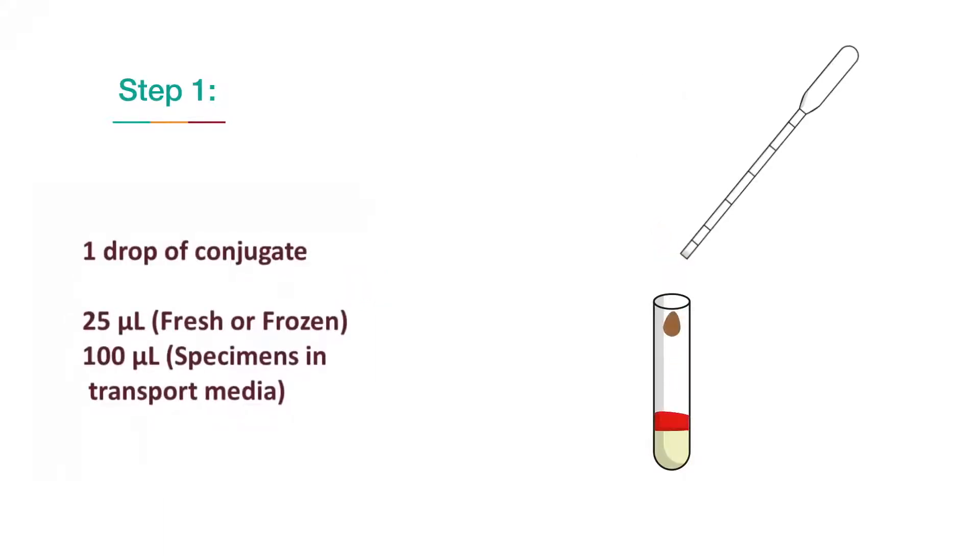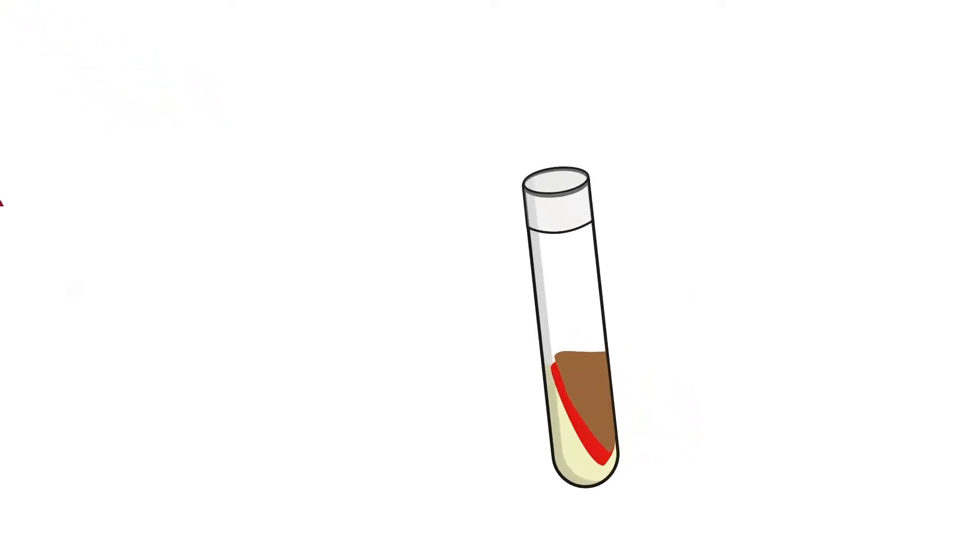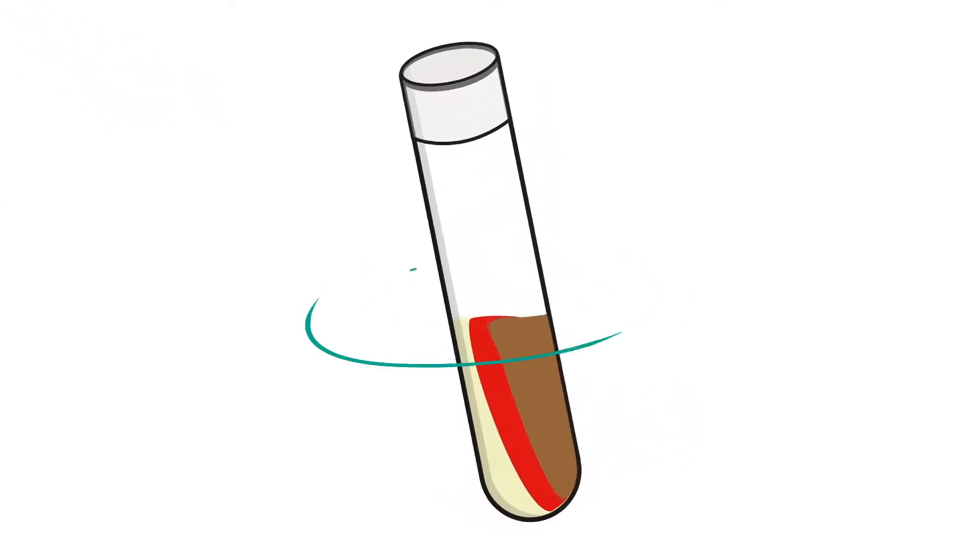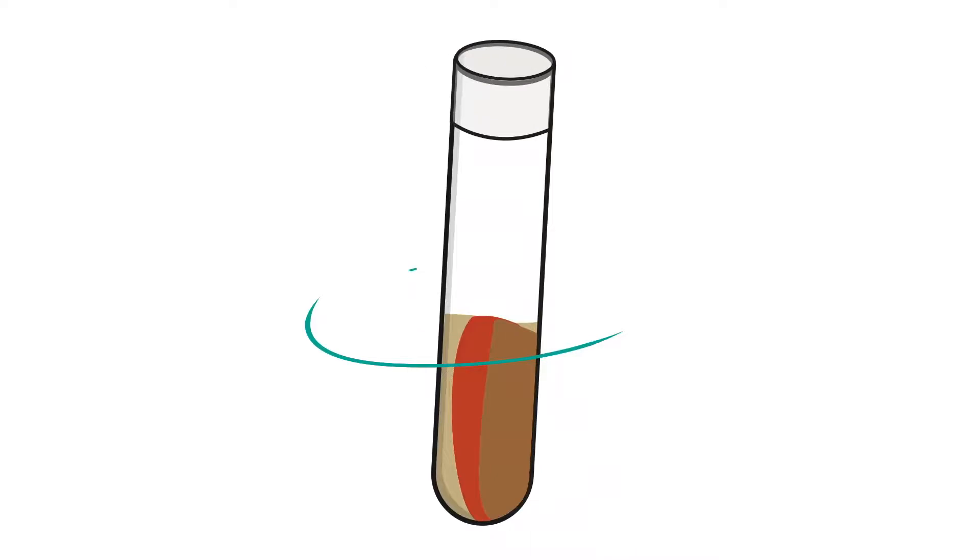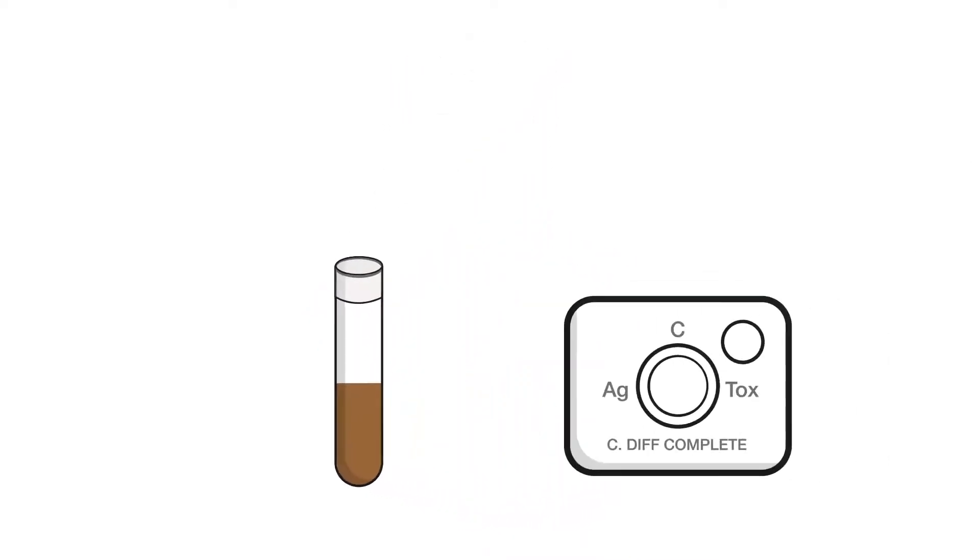Then, transfer the fecal specimen to the tube. Close the tube and mix the specimen thoroughly, either by vortexing or by repeatedly inverting the tube.